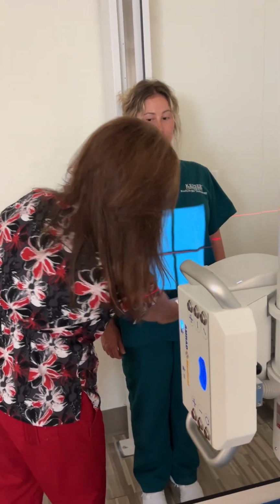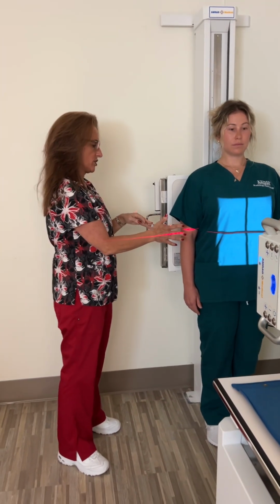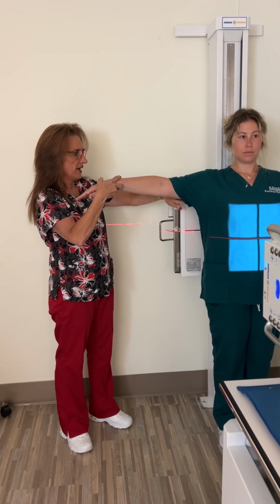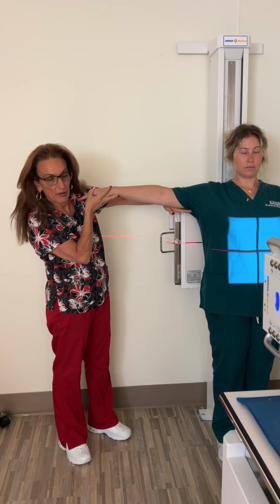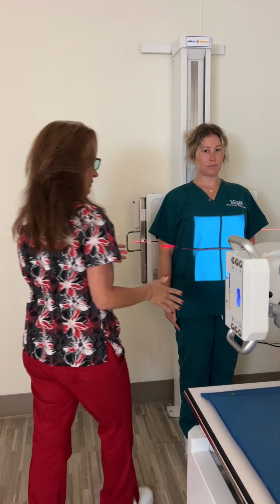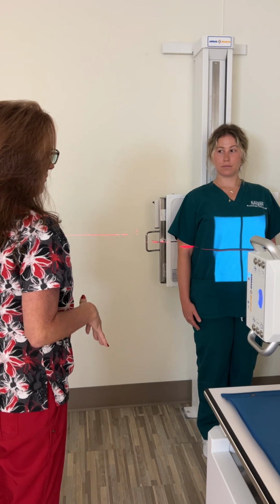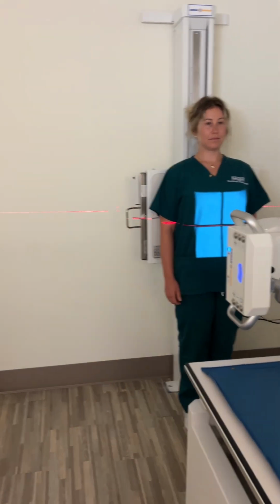And her arms can stay down by her side. Typically what they tell you is when this is positioned properly, usually what will happen is the top of the IR will be about the level of the axilla, and I feel like we're pretty spot on with that. So I feel like this is gonna be good. All right, I'm gonna have you just like that, and when I tell you, what I'm gonna have you do is take in a breath and then blow it all out, and you'll hold it out, okay? Okay, just like that. Take in a deep breath for me.